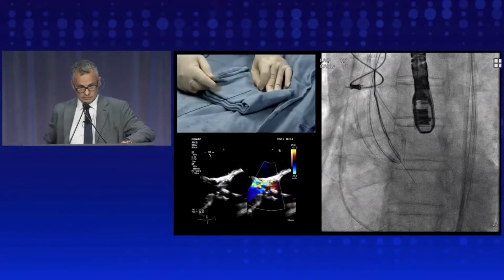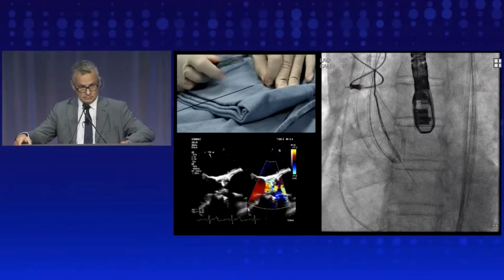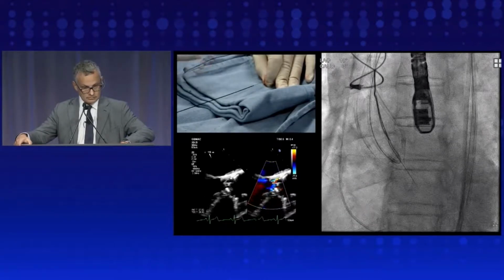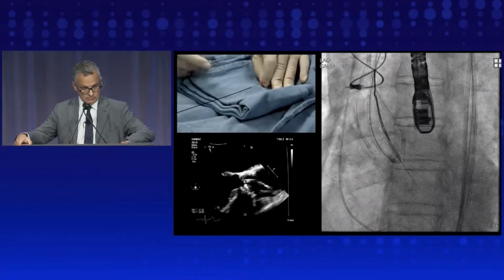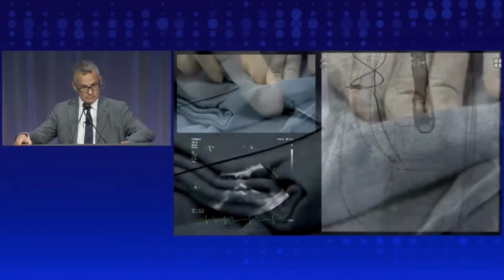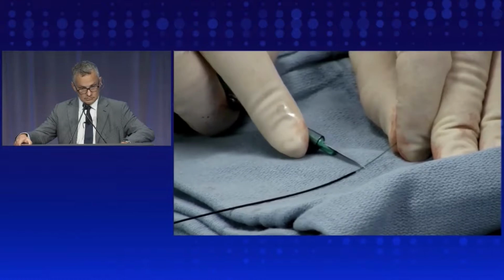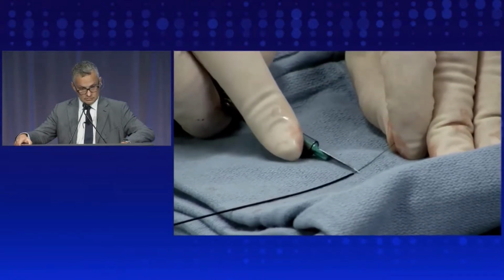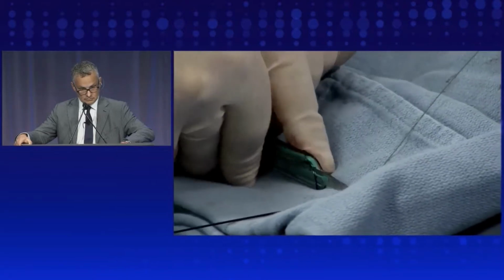So basically, the piggyback has a mechanism that it can lock over the wire. And we would like to create an area in which all the electrification will concentrate on the leaflet. So the proper technique is to denude the wire, not circumferentially, but approximately 5 millimeter after the piggyback exit, and then to create a kink in the middle part of it.